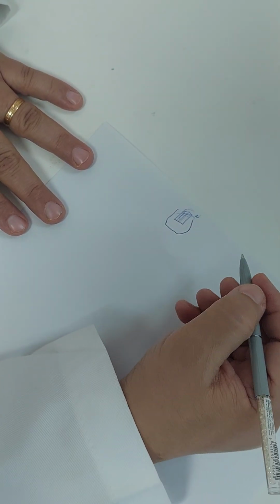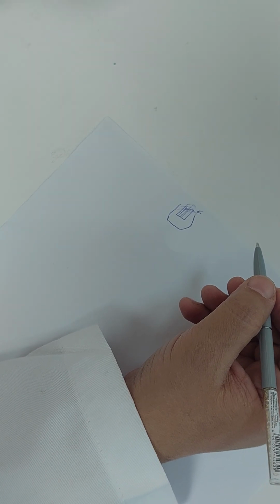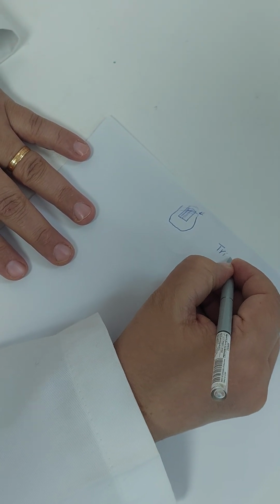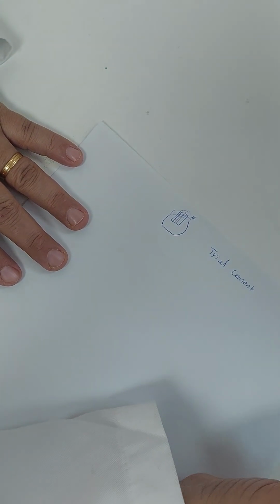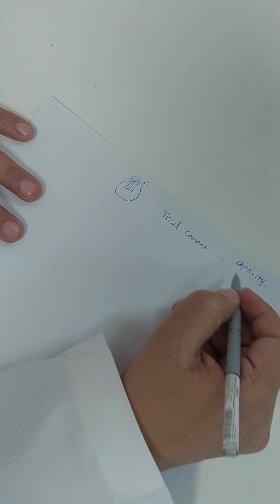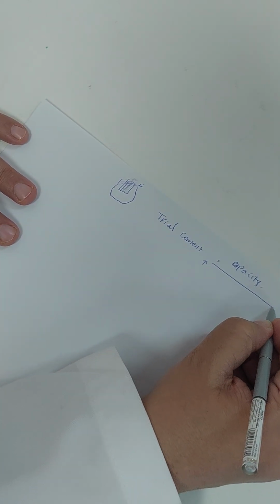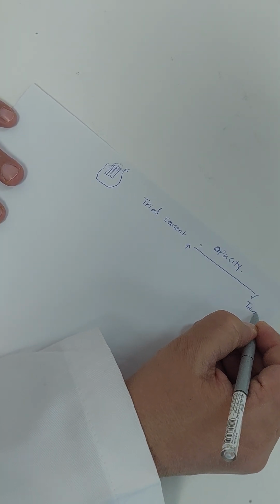So my discussion with the student was, do we use trial cements or not? I want you to note that trial cements are a variance of opacity, a gradient from maximum opaque to maximum translucency.